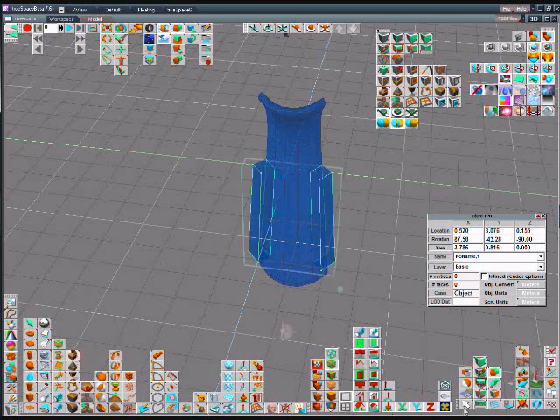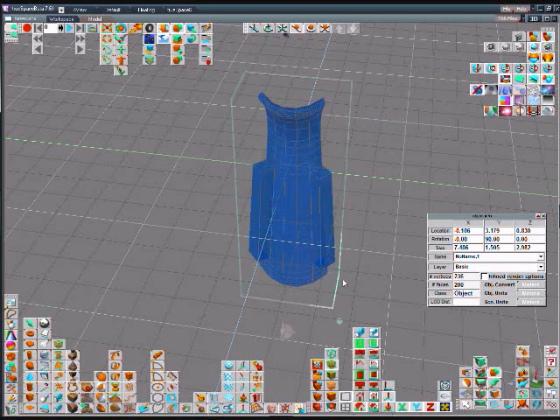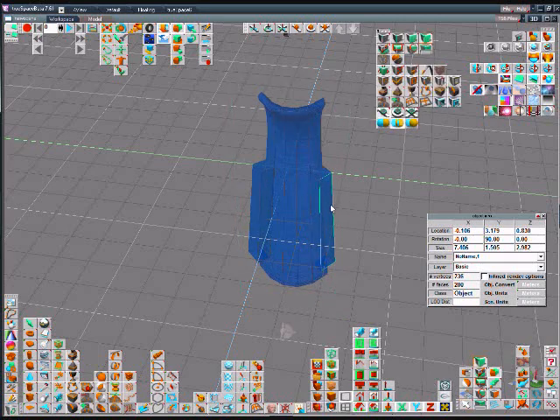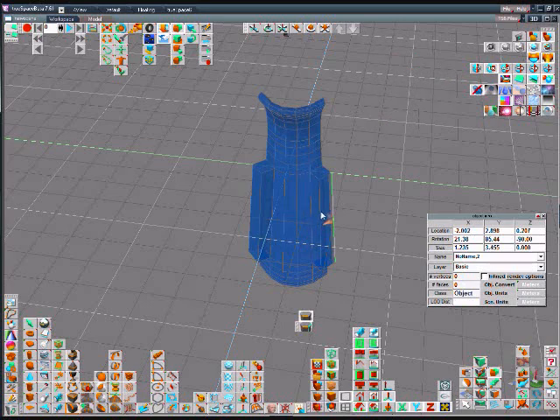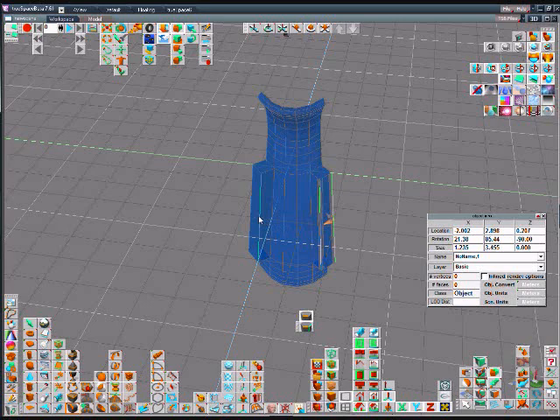We sweep that out one segment and we can also bevel those surfaces to take the edge off of them. I'm just picking the edges that we want to bevel or round.